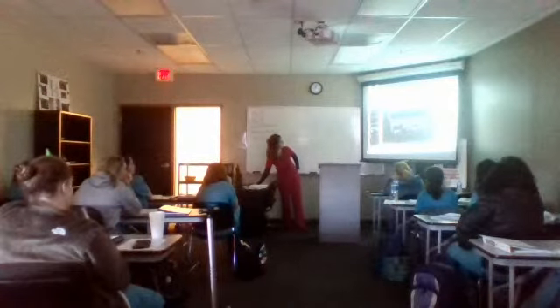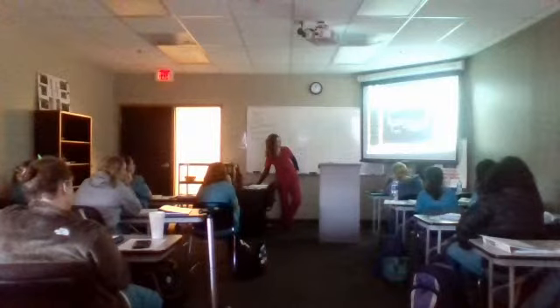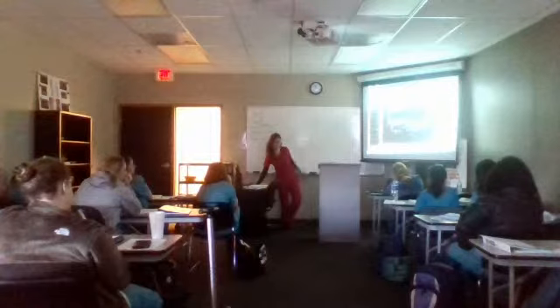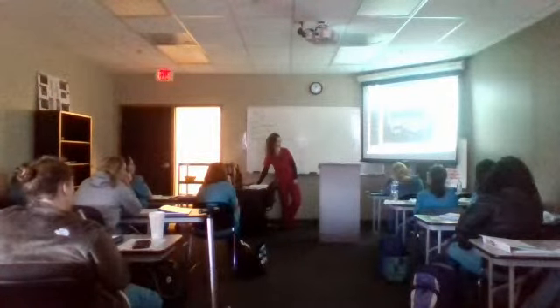Also, you can use color. They should fill in all the way. See the greater saphenous vein coming out over here? So they should fill up all the way with color. It's kind of like arteries. If they don't fill up, you're thinking plaque. If a vein doesn't fill up, you're thinking a blood clot.